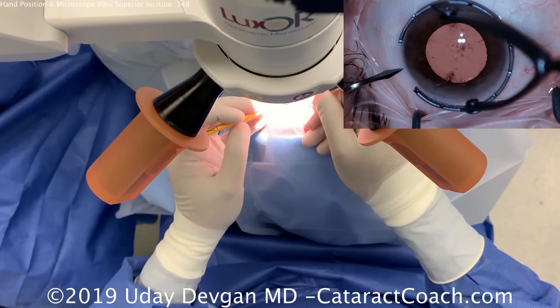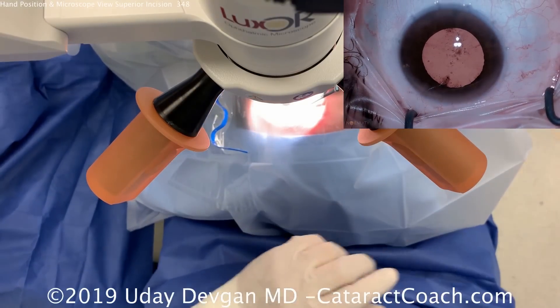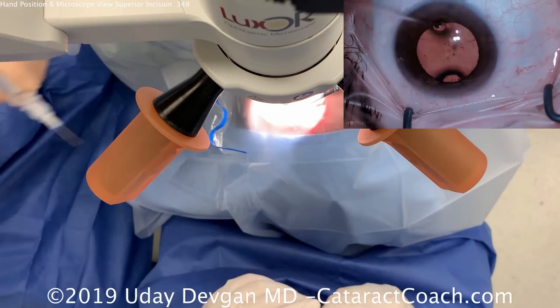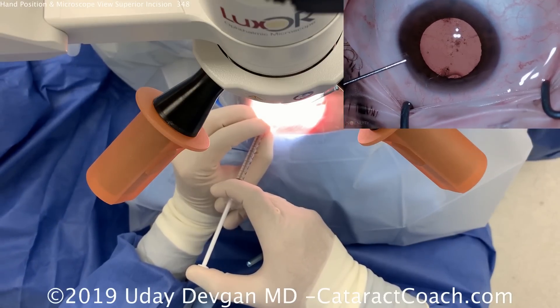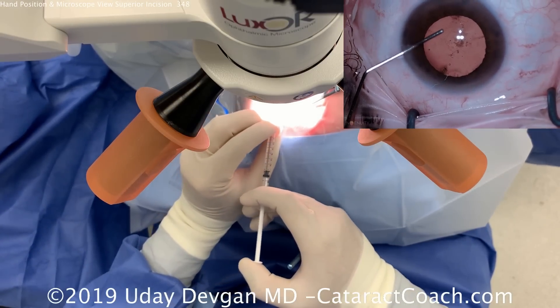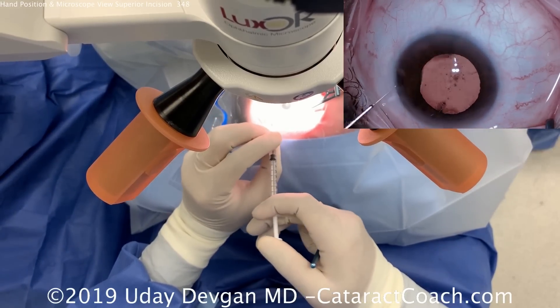What you see in the upper right corner is the surgeon's view. We're starting off making a paracentesis for the left hand. This is a good example of how to hold your hands during surgery. The left hand is holding the cannula tip like a pencil, the right hand is on the plunger, and we can inject anesthetic even going under the iris to put a little more inside the eye.